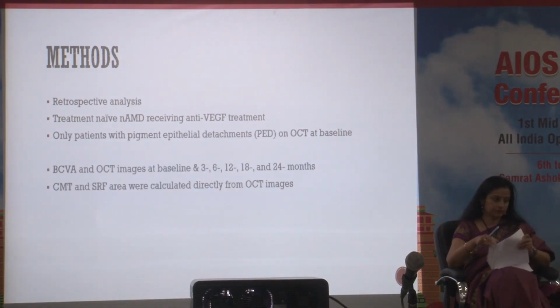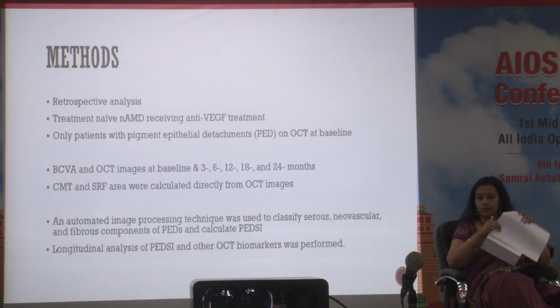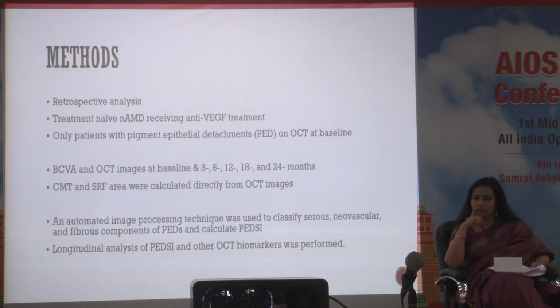BCVA and OCT images were taken at baseline, 3 months, 6, 12, 18 and 24 months. CMT and SRF area were calculated directly from the OCT images, and we used an automated image processing technique to classify the PEDSI components into three, that is the serous, neovascular and the fibrous components, and we did a longitudinal analysis of the PEDSI and other OCT biomarkers.